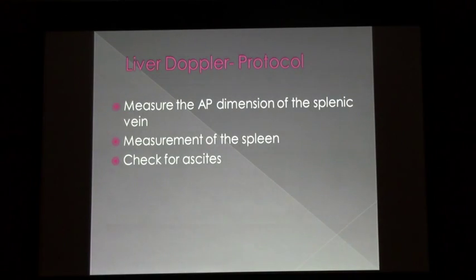Oh, I see they did a color for egress and then, okay. Yeah, and that was all in the same patient. There were images by the pancreas with color, but they took their Doppler by the spleen. Does it matter? No. What matters is we know the direction and we can assess that from it. That's really the key thing. So velocities in the splenic vein, nobody really cares about. It's more the color flow and direction.